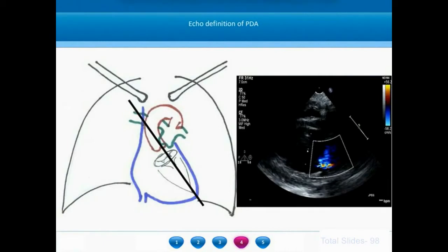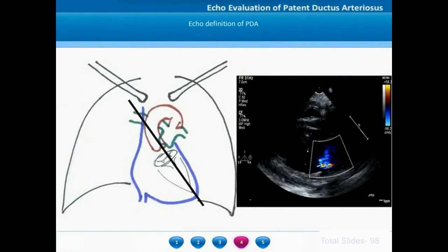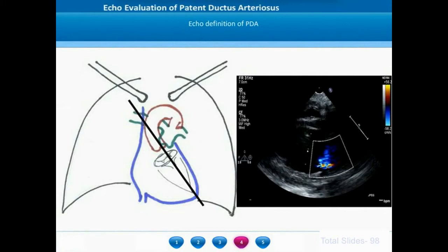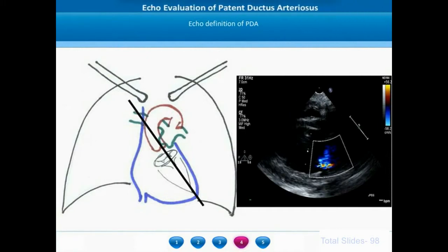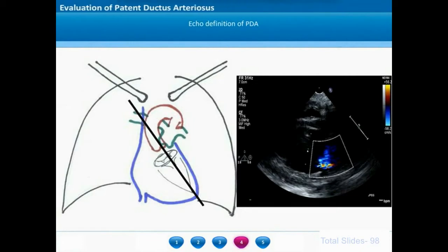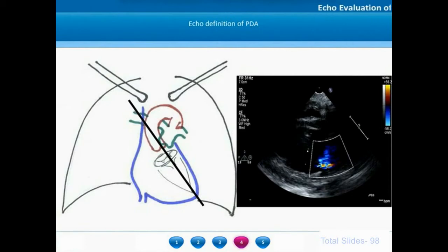Conventionally, an echocardiogram starts with the long axis view imaging of the heart. On parasternal long axis view, we place the probe along the long axis of the heart, which lies along the line from the base to the apex. The base of the heart will be at the level of the aortic annulus. The parasternal long axis view shows the left ventricle inflow and left ventricle outflow.